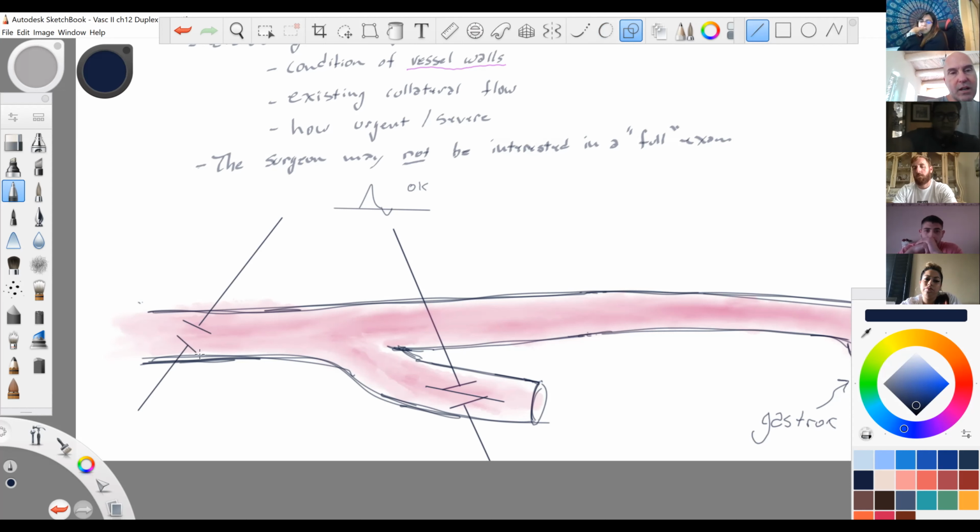On this person, I got way on my heel. Maybe I steered it a little bit as well. I did everything I could to get a good Doppler waveform, and sure enough, I get a triphasic. So that's what we want to see, something like that.